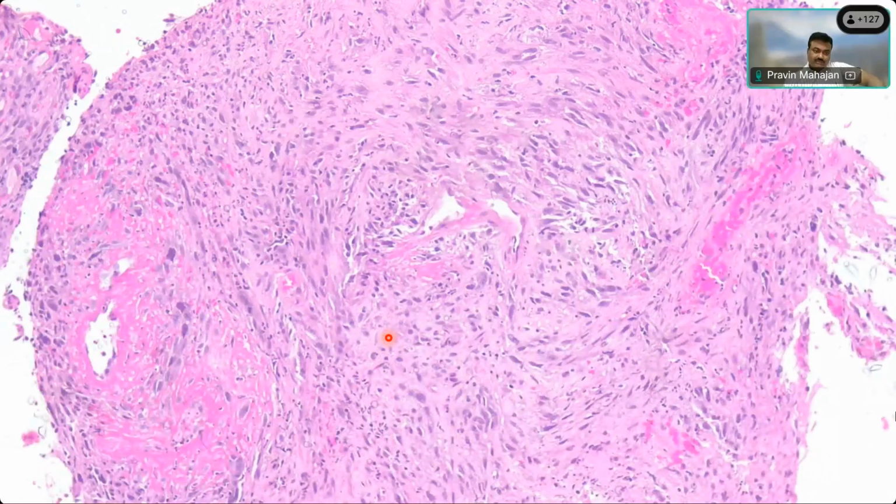Another area showing the same thing. There is some perivascular arrangement of the cells here, some fibrin around the vessel, but the rest of the area is showing spindle cells. Again, here it is more haphazard, but the cells are definitely spindle because the nuclei are elongated. Those are infiltrating into the stroma, inciting this stromal response.